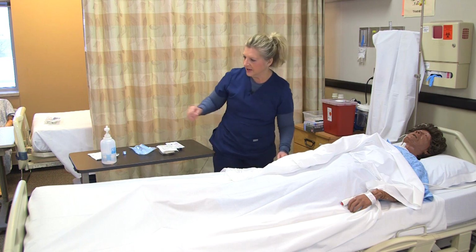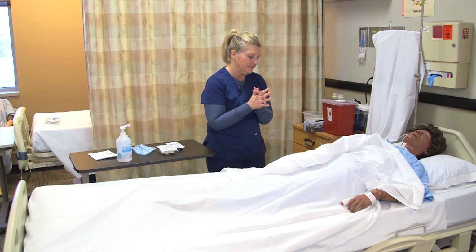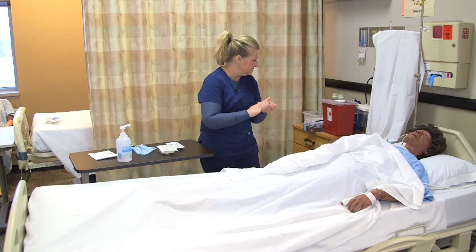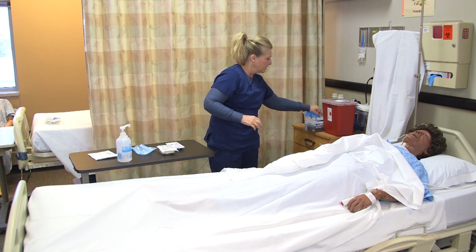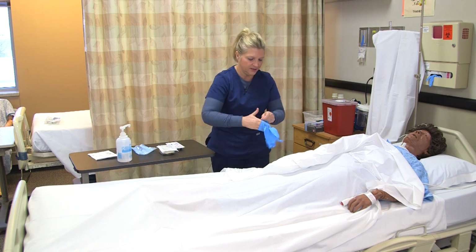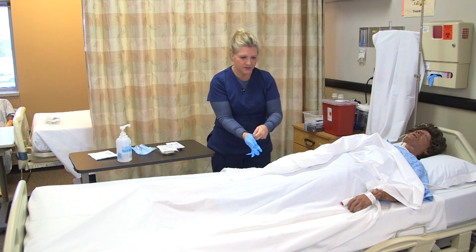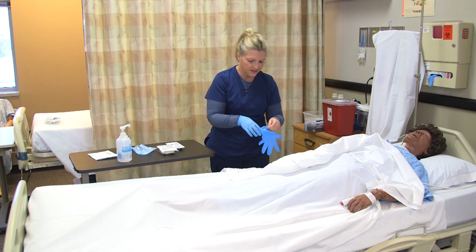Okay, so I have my patient's extremity here that I'm going to be evaluating the veins in. And many times when we're performing IV starts, it's best to try to find a very good vein, if you can, to start that IV. It causes less pain for the patient, and the vein will last a little bit longer, especially for giving medications. I'm going to go ahead and place my gloves on.